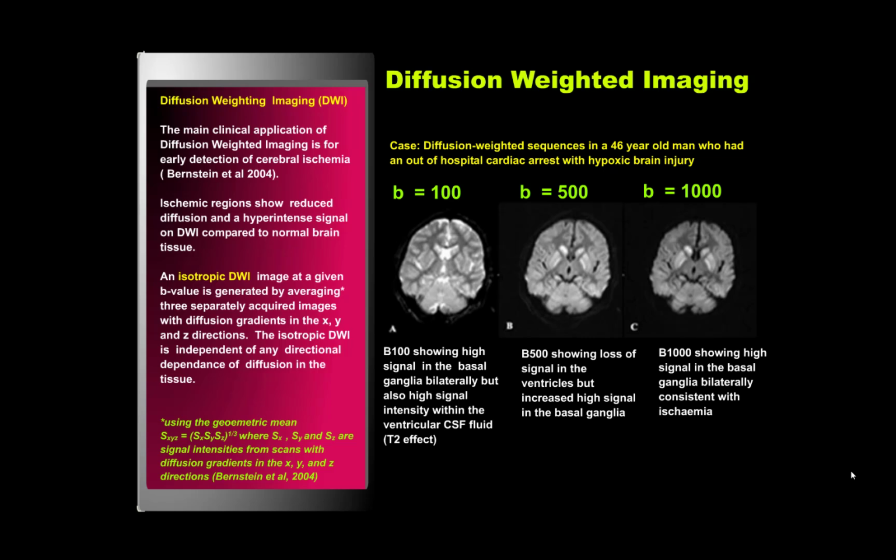And because of that averaging, the dependence on direction has been removed and the intensity values are related to diffusion independent of direction.